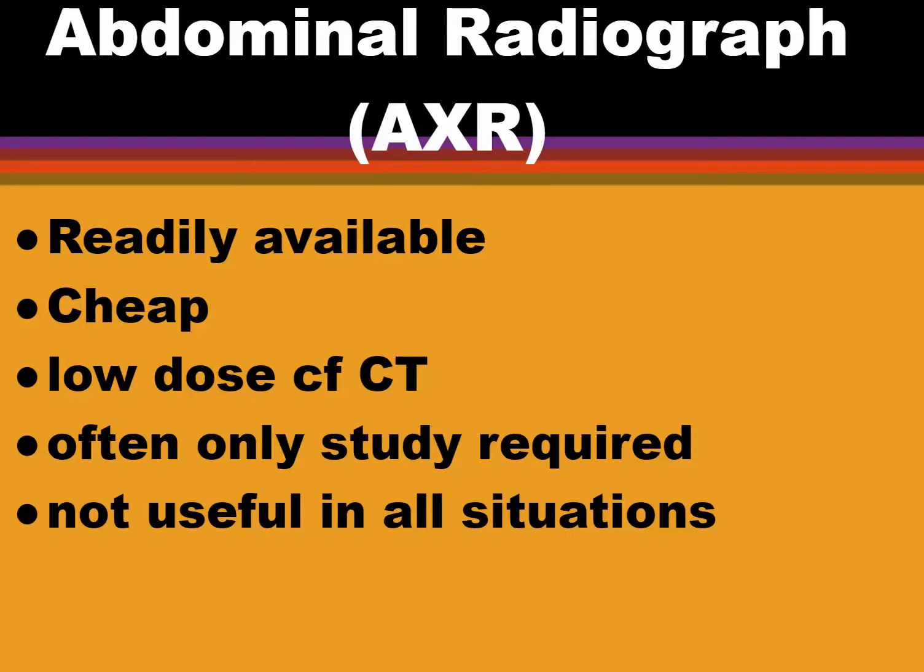It's often the only study required to make a diagnosis, but this isn't the case in all situations because it can sometimes be regarded as a blunt tool, and as CT becomes much more available, abdominal X-rays are being used less and CT is being used more because it just gives you much more information. It's not useful in all situations.